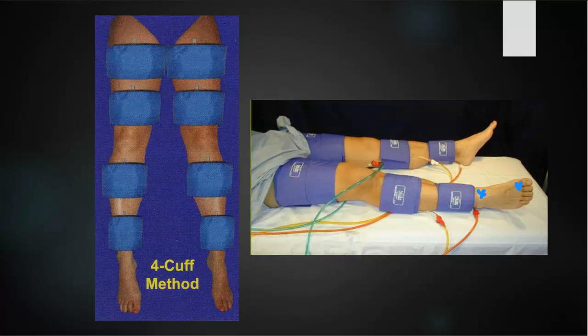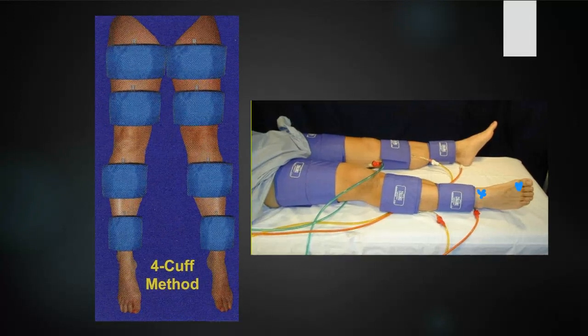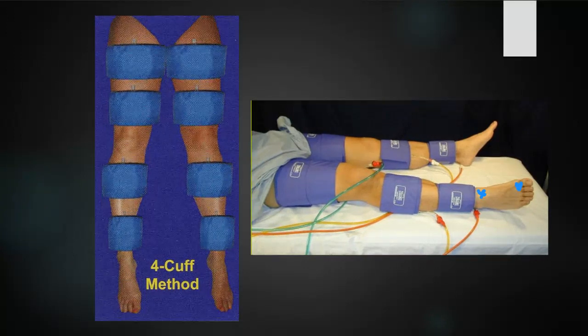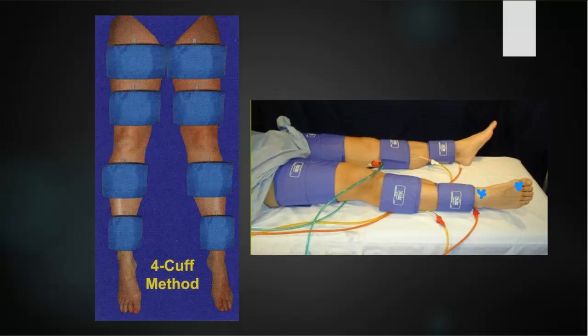Now, of course, if we're used to doing a 4-cuff method and we have a patient who comes in and she is 4'8", we are not going to be doing a 4-cuff method, right? Because her thigh is not going to be long enough to fit 2 cuffs on. So we're going to modify and drop down to a 3-cuff method.